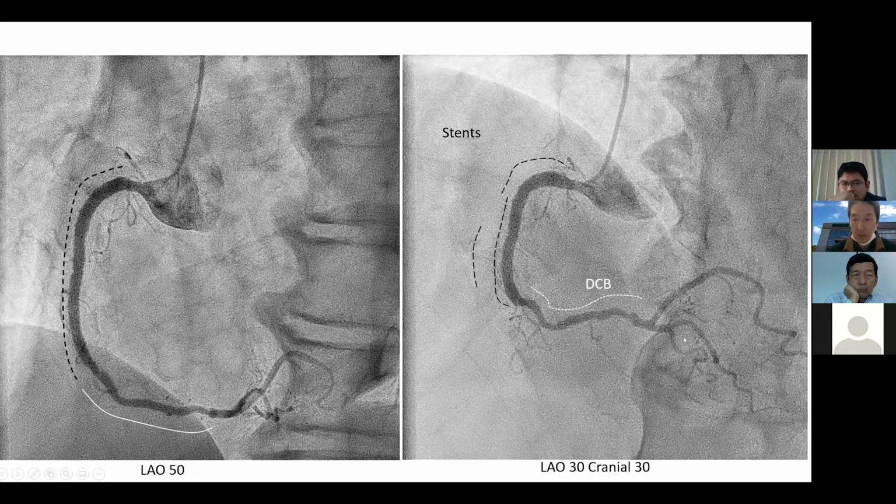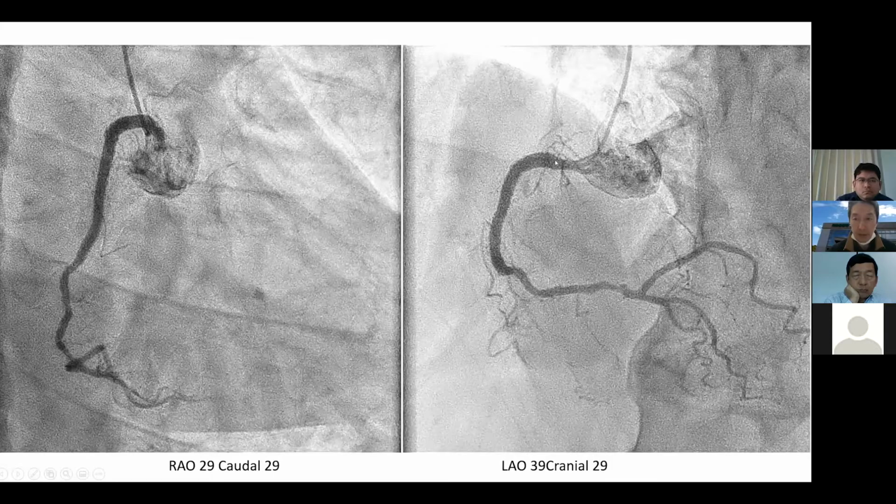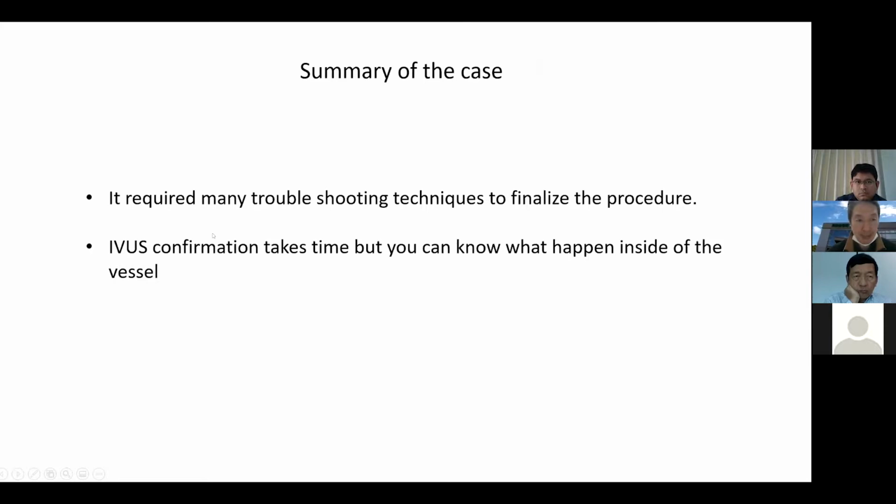The stent is fine. The dissected ostium is almost fine. So the summary of the case: it requires many troubleshooting techniques to finalize the procedure. IVUS confirmation takes time, but you can know what happened inside of the vessel. Thank you for your attention.